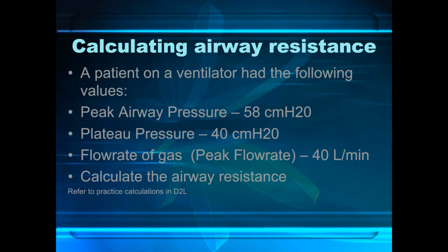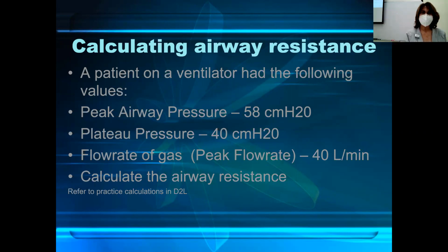I got 27 centimeters of water per liter per second. 27.0. Yes, please.